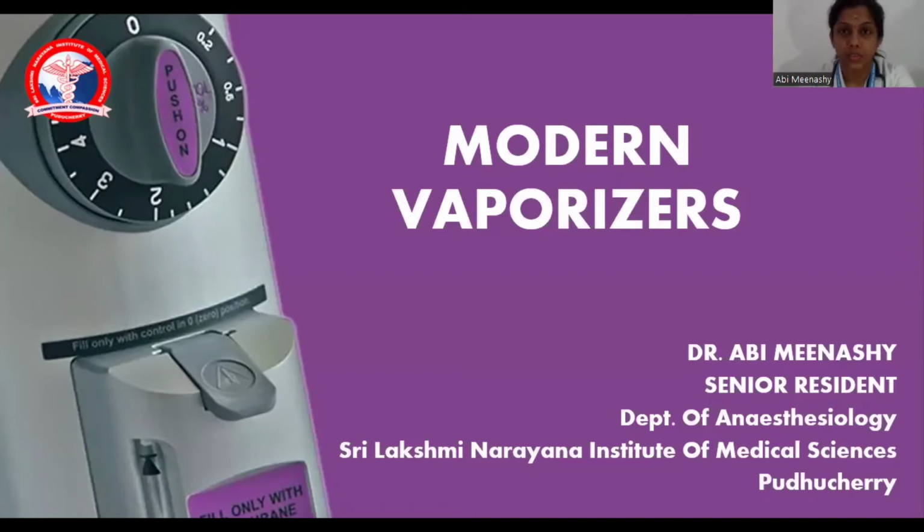We've read about saturated vapor pressure and critical temperature, boiling point, and specific density. So we know that each and every inhalational agent varies in their own physical properties. Therefore, the vaporizer should also vary since every vaporizer is agent specific. And keeping in mind the physical properties, we've engineered these vaporizers. And now we'll see how each and everything works.